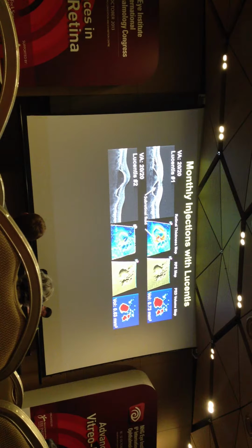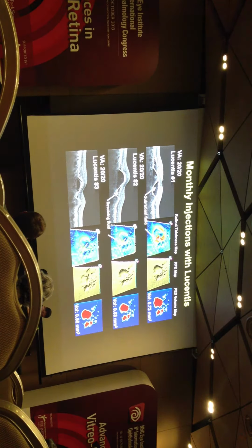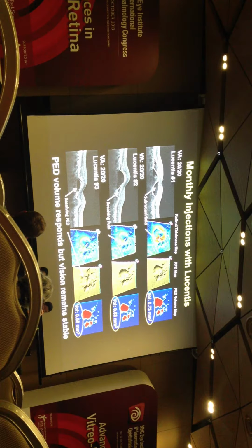Patient comes back a month later, and look, the fluid's going down. A month later, after another injection, much better with resolution of the pigment epithelial detachment. And you can appreciate that in the volume measurement. It's just reassuring to see that the volume measurement is going down. The volume responds, but the vision remains stable.